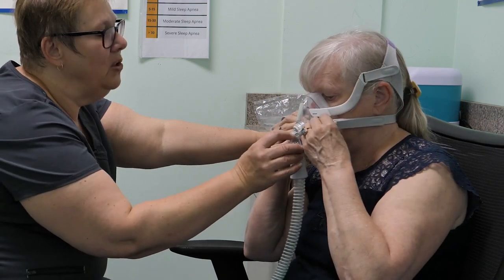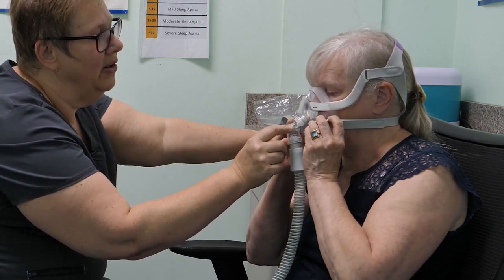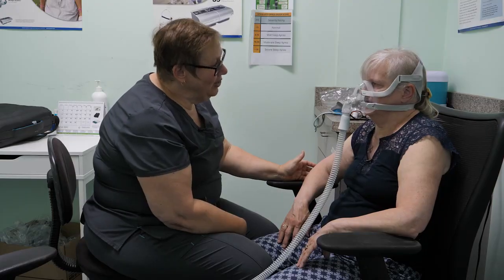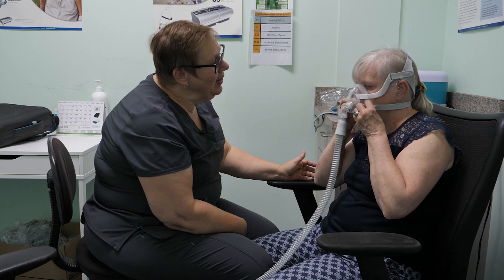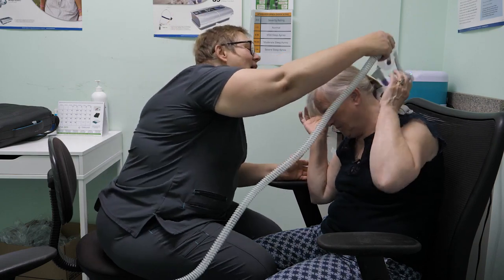So you might have to do it with one hand on one side and hold the mask on the other. Is that it? You got it. Good job. So I would like you to take the mask off now using just the magnets. They're right at the front, just about there. There you go. And you can just lift it off over your head. There, caught on your ponytail.